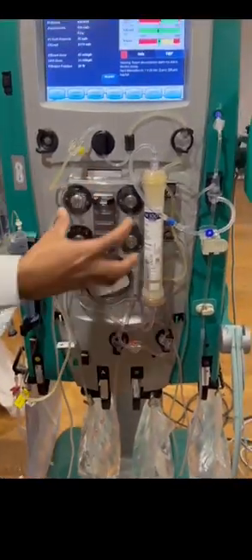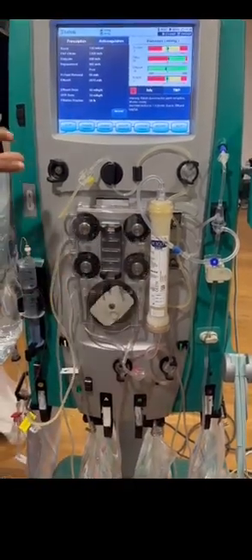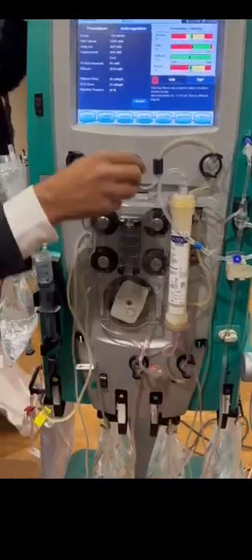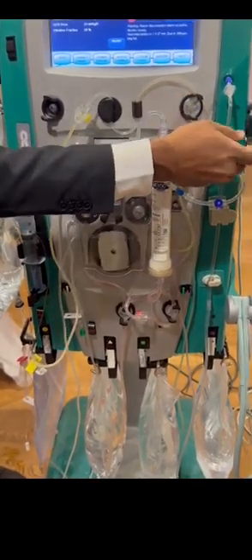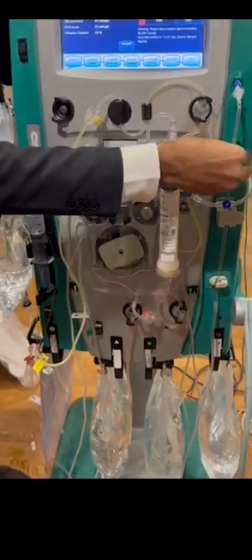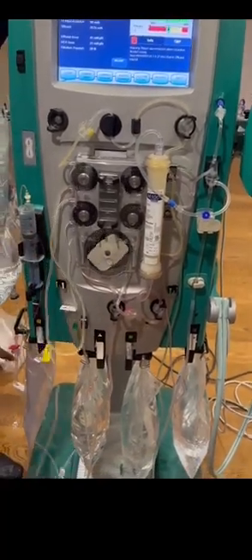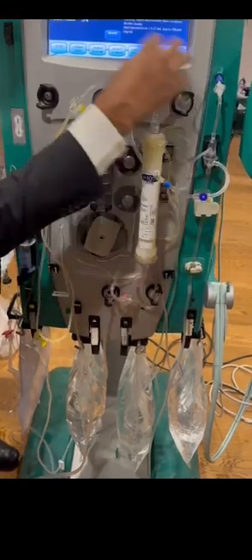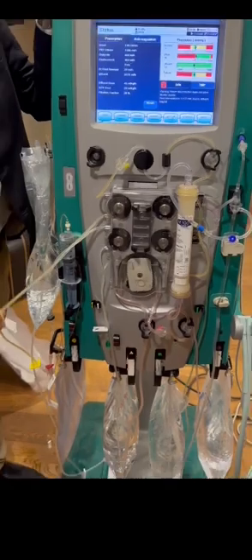So these three pumps will take these solutions and deliver them to different areas. Dialysate will be delivered to the dialysate compartment, replacement to the replacement. The circuit means the extracorporeal circuit, after the filter, and this will give before the filter, and this one will take all the solutions and drain to the bag.